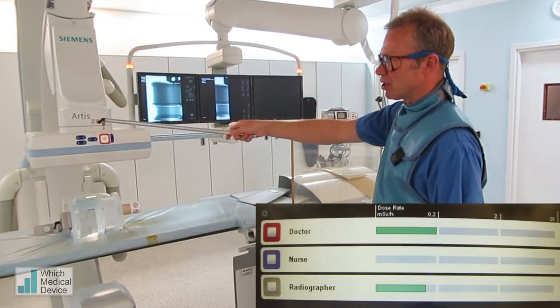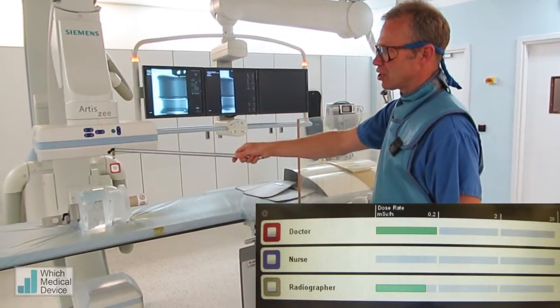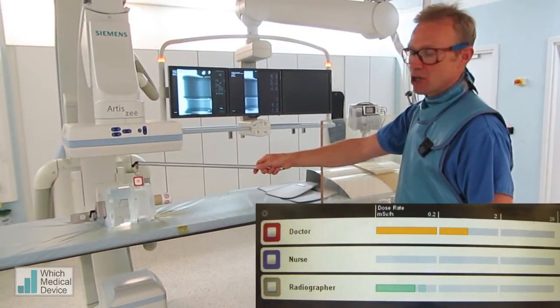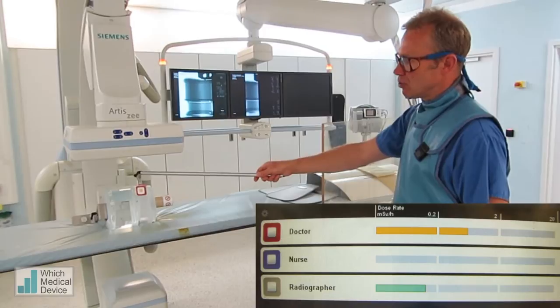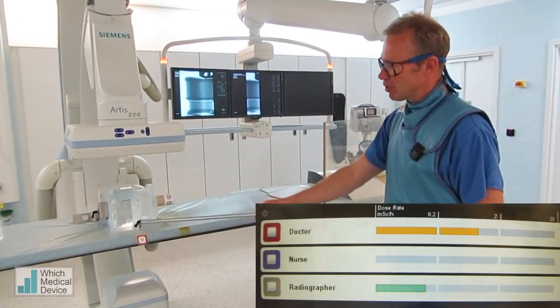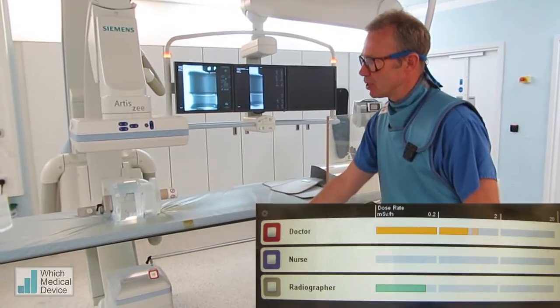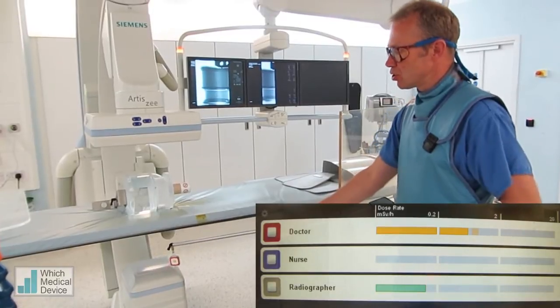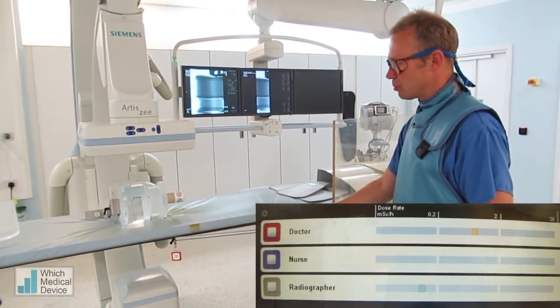Now we're going to lower this badge down and get it a little bit nearer to the phantom we've got set up here. And now we're starting to get more scatter — you see the dose goes up into the orange. Moving it down to about waist height and a little bit further towards where your legs will be, the dose here is still quite significant. But of course there are various things we can do to reduce this dose, which I'm going to show you in just a moment.